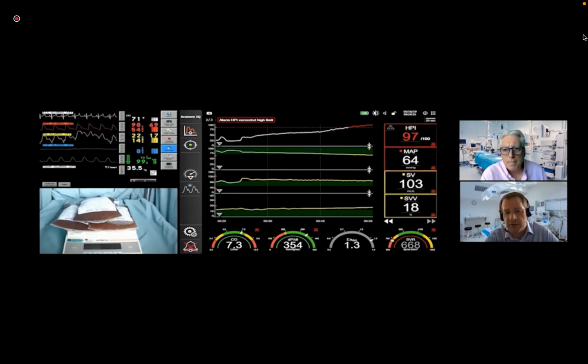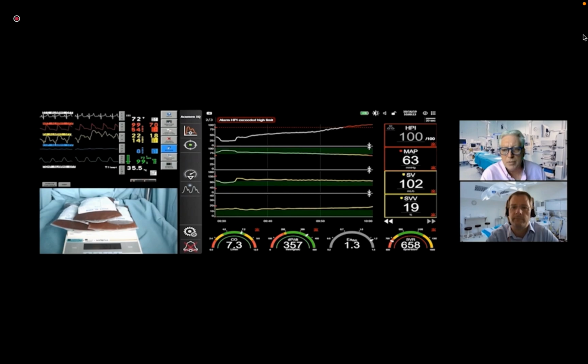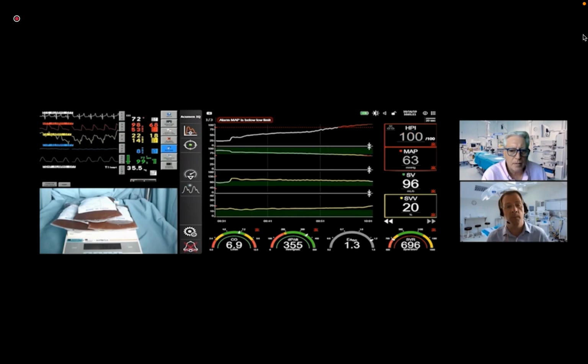And that 500 mil hemorrhage has to be compensated for by something. And as you were saying, Monty, that's mobilizing that unstressed volume into our stressed circulation. And now the MAP is dropping on the right-hand monitor to a level whereby we should probably be doing something about it in isolation, but we've got a lot of blood in the bucket now as we begin to become hypotensive, and the SVV is taking a proper kick up now. Yeah, and only now we're starting to see our stroke volume start to decrease, and that's physiological. We compensate until the very last, until we can compensate no more. So dropping stroke volume and changes in CVP, PA pressures, very, very late indicators of significant hemorrhage.